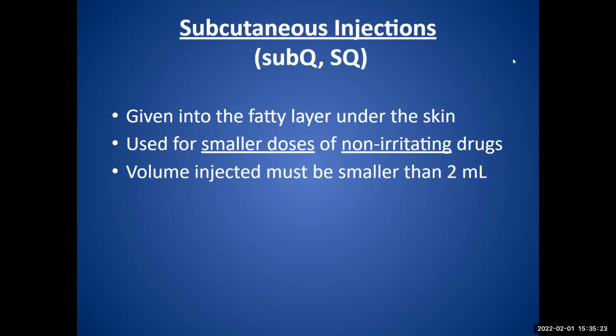The volume in your syringe must be smaller than 2 mLs. Anything greater than 2 mLs shouldn't be given into one site and into the same subcutaneous layer.